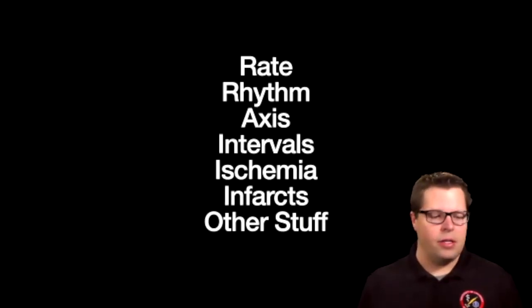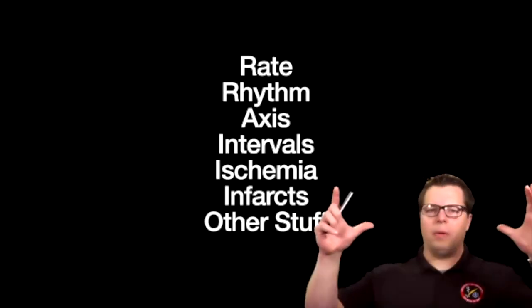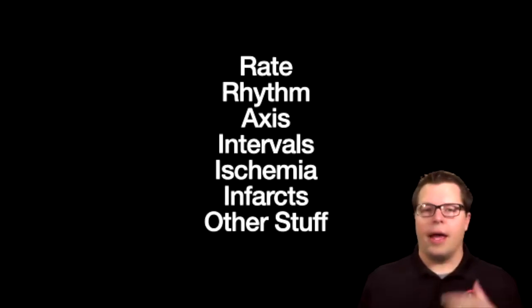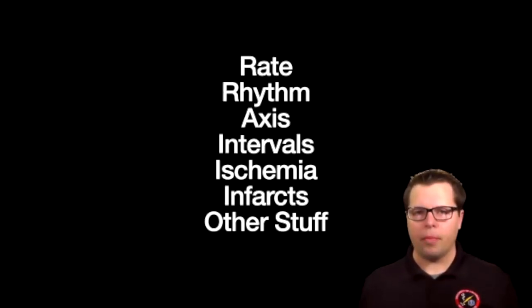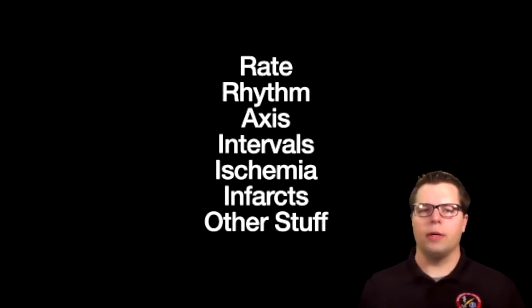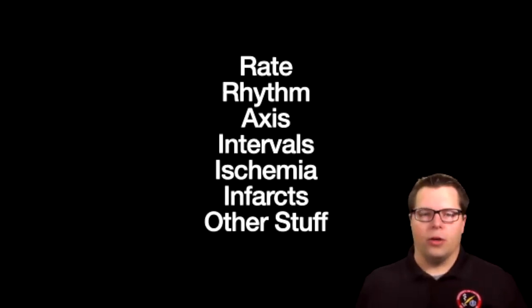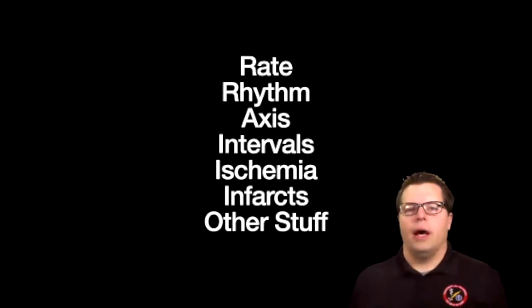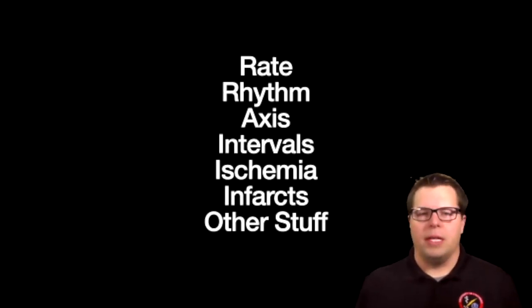When we are looking at an EKG, don't look at the big picture and say, oh God, what do I do with this thing? This looks funny. What's this over here? You've got to have a systematic way of going through it. Once you develop that systematic way of going through it, things actually get quite a bit easier. Not knowing anything else, just having a good way to go through it to sort out what each of those things means is really important.